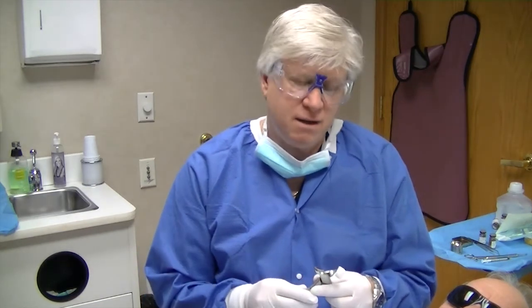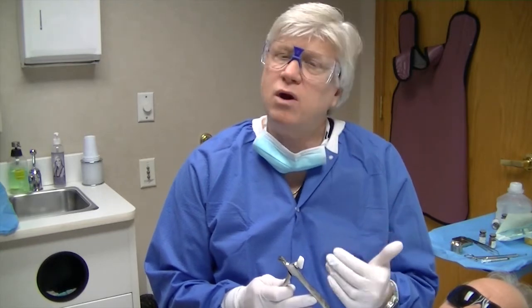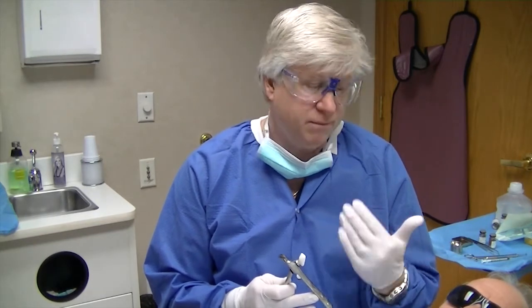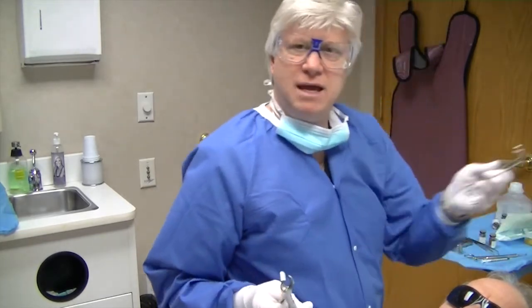So our patient is pretty numb, hopefully very cooperative today. What we're going to simply do is engage the beak onto the lingual surface of the root as far down the tooth surface as we possibly can. The bumper will engage the vestibule area, and again, the design allows us to work in a shallower vestibule area. The rotation is similar to the Physics forceps — you're only using wrist motion, no bicep or forearm motion, and it's similar to turning a doorknob. So let's engage this and demonstrate the technique.